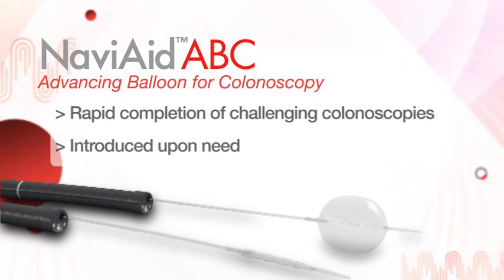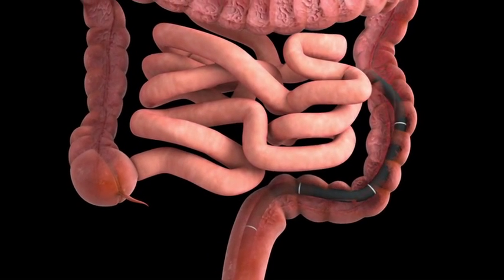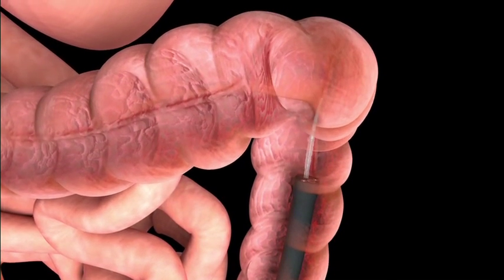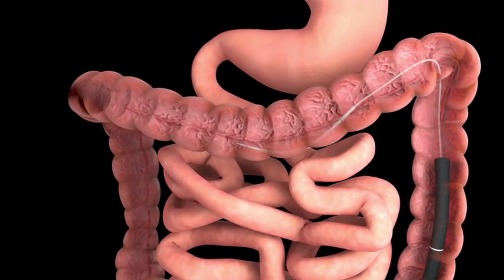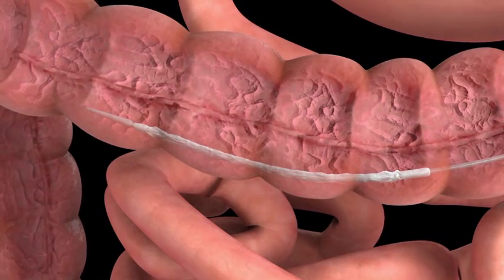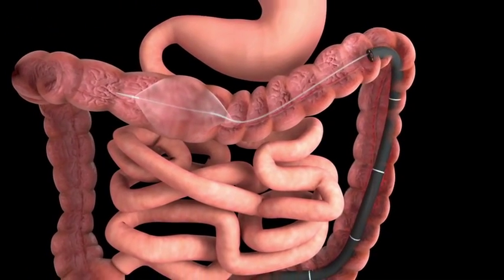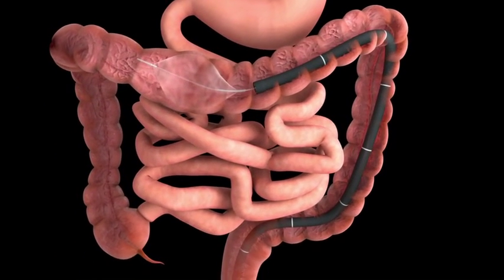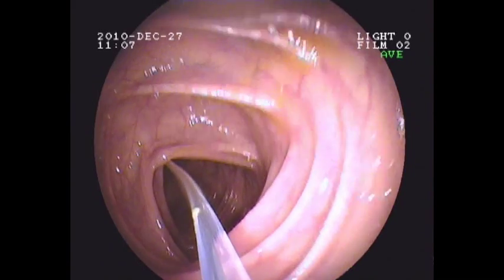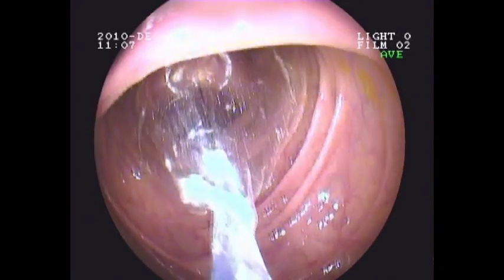The Naviaid A-B-C device enables swift completion of challenging colonoscopies. During the colonoscopy, upon need, the device is introduced through the colonoscope's tool channel and advanced beyond the challenging segment of the colon. The balloon is then unfolded and inflated to anchor the colon, enabling the colonoscope to be advanced using the device as a guide. This sequence can be repeated several times as necessary, allowing fast and safe intubation of the entire colon.